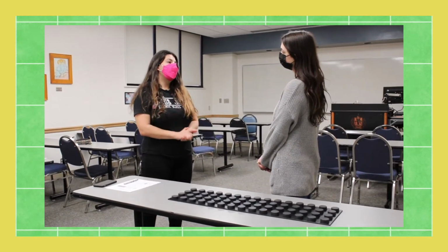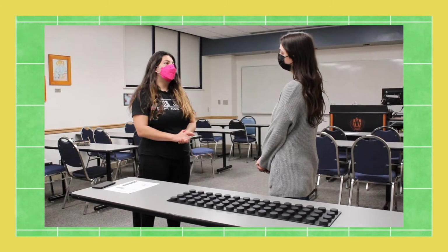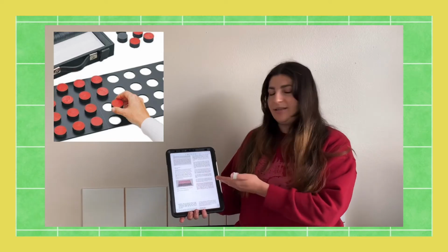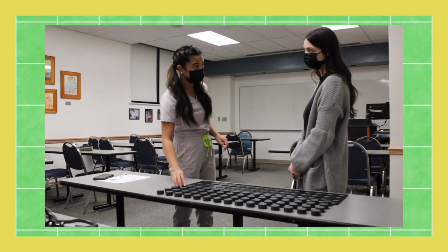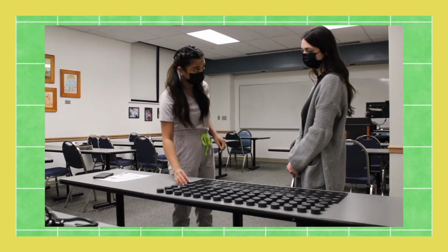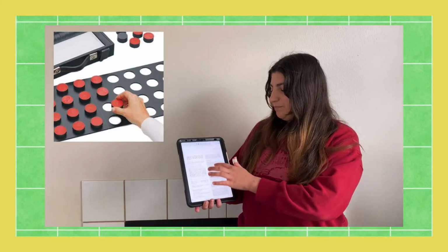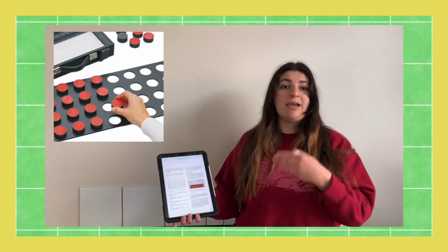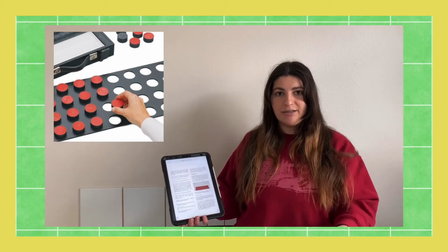This script is basically a step-by-step of the instructions that the patient will need to do. Once you explain the steps to them, you're going to demonstrate the test yourself so they can have a visual demonstration as well. After you do so, you click the timer and tell the patient go. They perform the test, and once they're done, then you hit stop.